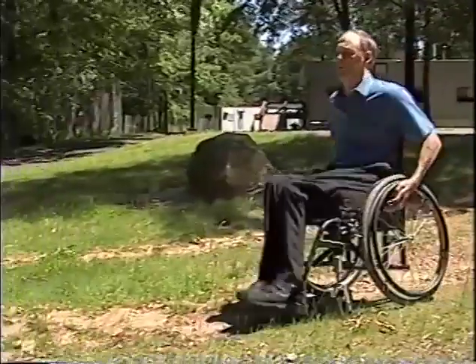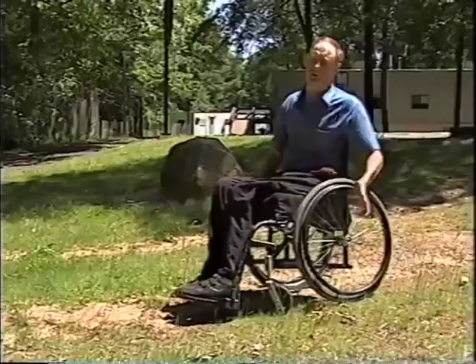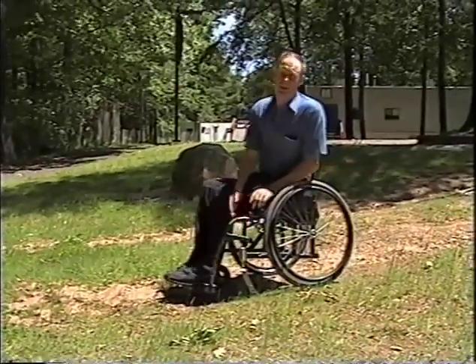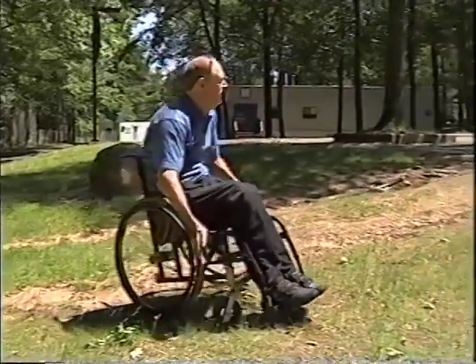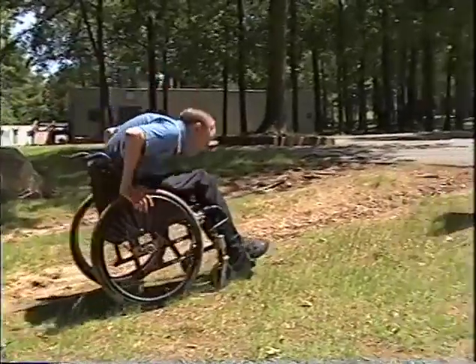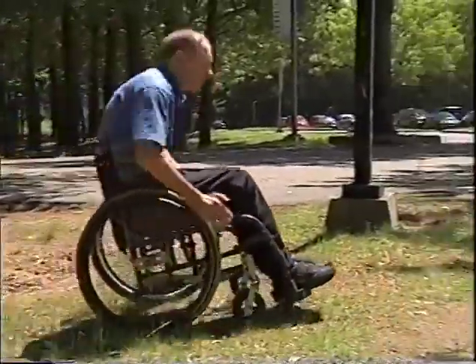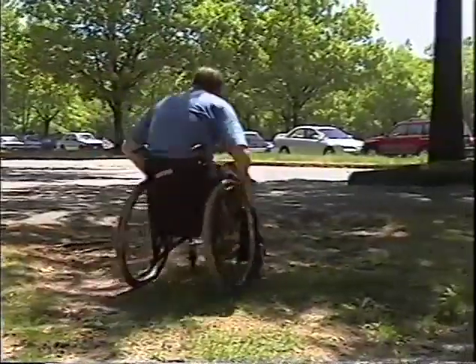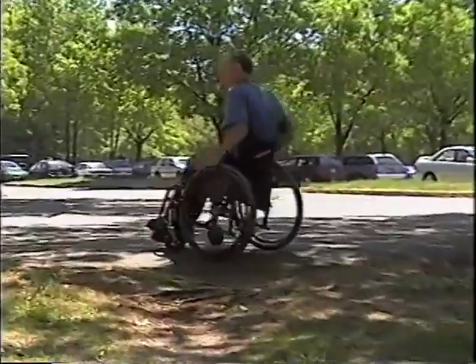If you need to stop, just pull backwards and you'll pull the front end down. But this is a very good way to be going down, rather than having your front end, the small wheels, hitting every nook and cranny and causing you problems. Going up this rougher terrain, if it gets too steep, pick a different angle. If you can't wheel up it this way, take a little traverse, come across it. Work your way up on the little flat spots, picking transition areas, keeping your weight forward, and then pushing.